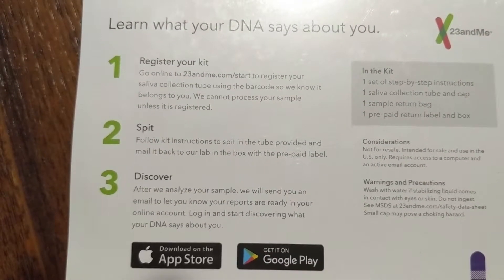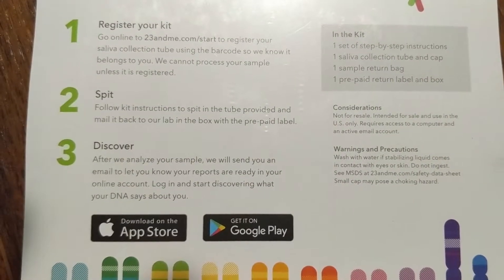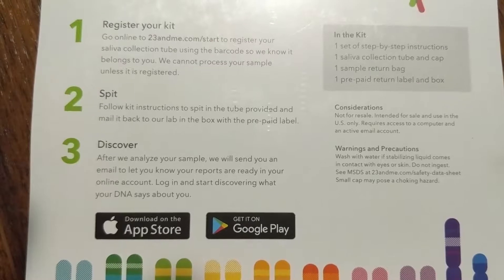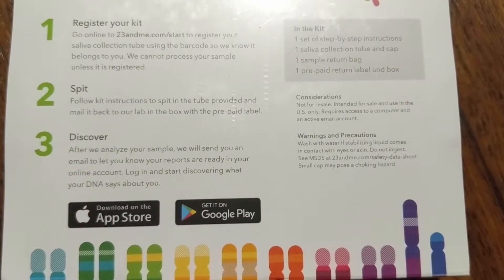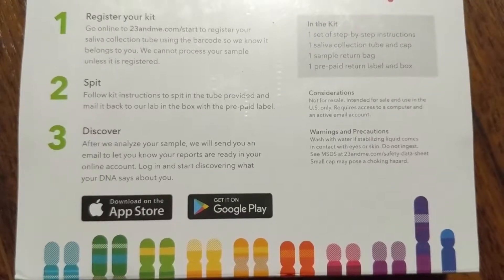First you need to register the barcode on their website. Then follow the instructions, spit in the tube, and mail it back to the lab in the box with the prepaid label. After your DNA is analyzed, they'll send you an email and you can log into their website to look at your results.